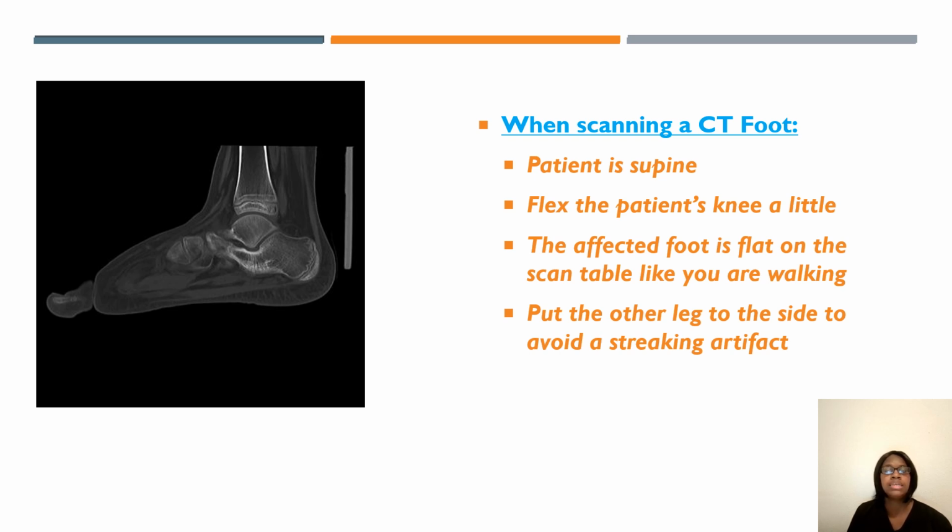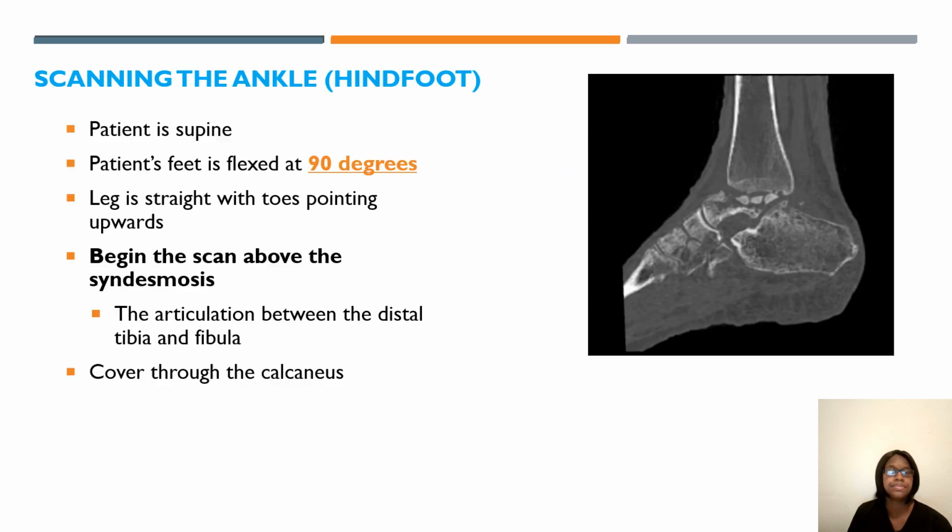If you are scanning a CT foot, the patient is going to be supine. Have the patient bend up their knee just a little bit. I always have the patient put the bottom of their foot on the table like they're walking on it, kind of flat on the table. And then they can move the other leg to the side so that the streaking artifact does not occur in the images.